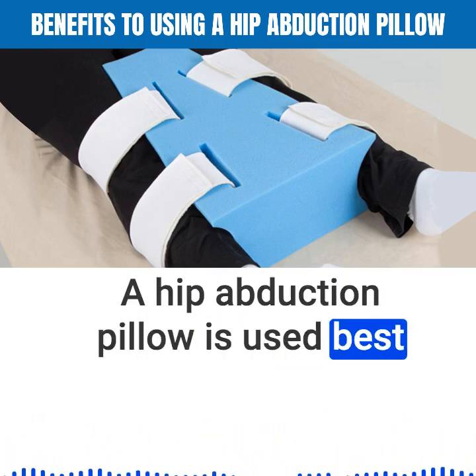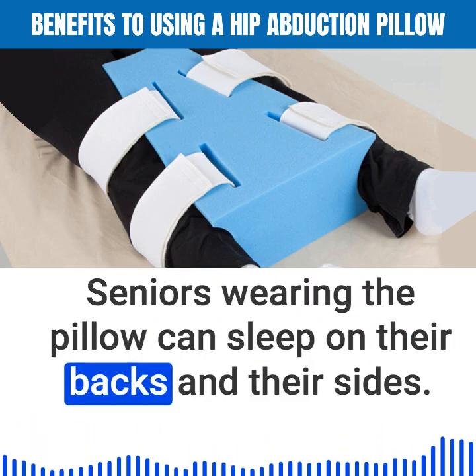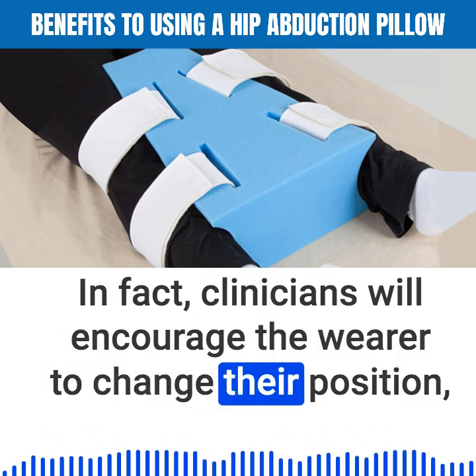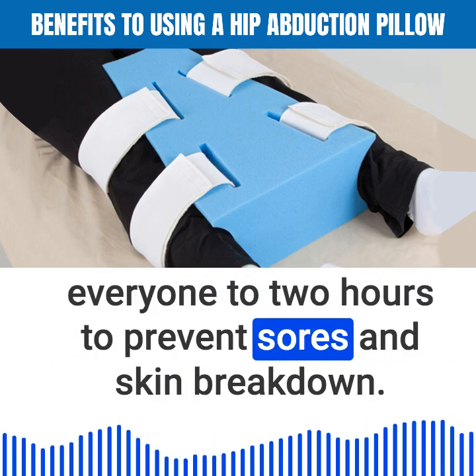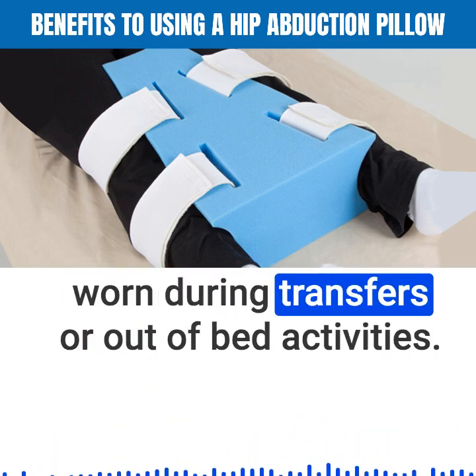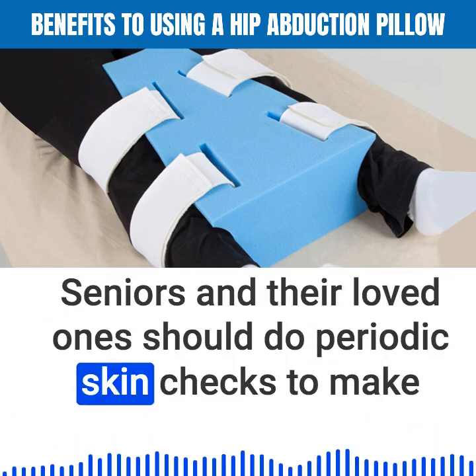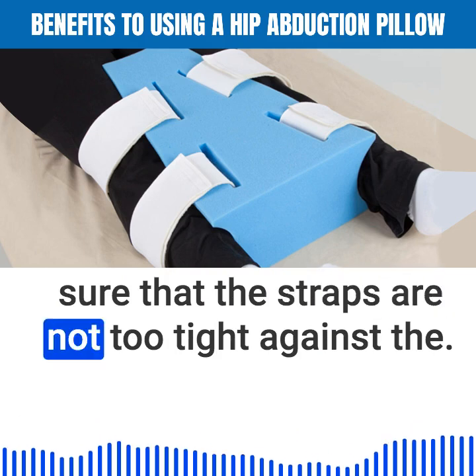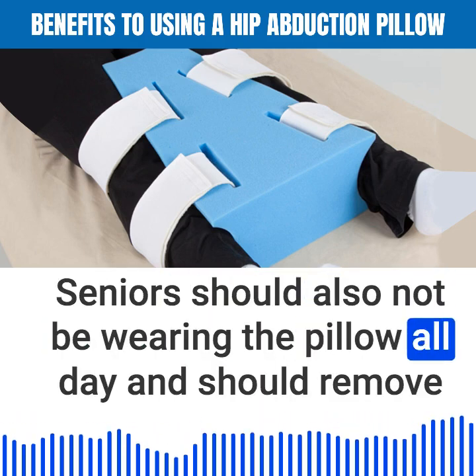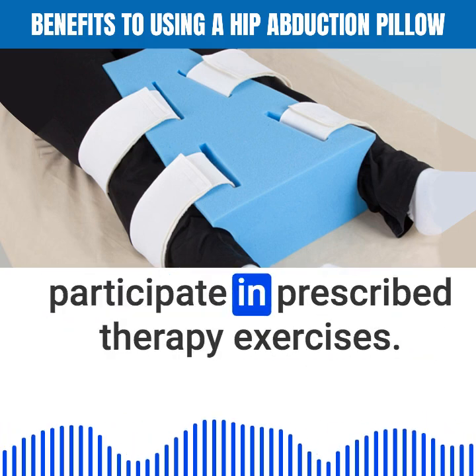A hip abduction pillow is used best while lying down or during nap times. Seniors wearing the pillow can sleep on their backs and their sides. Clinicians will encourage the wearer to change their position every one to two hours to prevent sores and skin breakdown. Hip abduction pillows are not meant to be worn during transfers or out-of-bed activities. Seniors and their loved ones should do periodic skin checks to make sure that the straps are not too tight against the skin, and should remove the pillow frequently throughout the day to participate in prescribed therapy exercises.